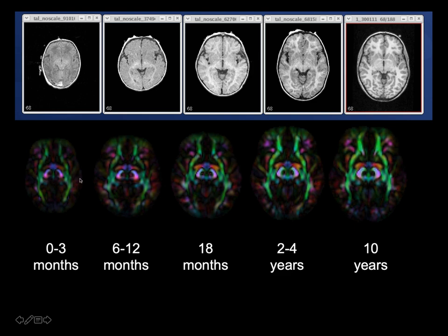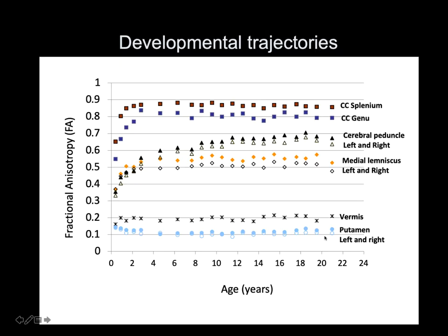Look how interesting is the evolution of white matter structures in these. This is babies from 0 to 3 months. And this is conventional MRI. As you probably know, in conventional MRI, the contrast between gray matter and white matter changes throughout the initial stages of postnatal development to the point in which sometimes you don't even differentiate gray matter and white matter. And you can see that on tensor-based data, you can see all this arborization of the white matter tree that becomes richer and richer.